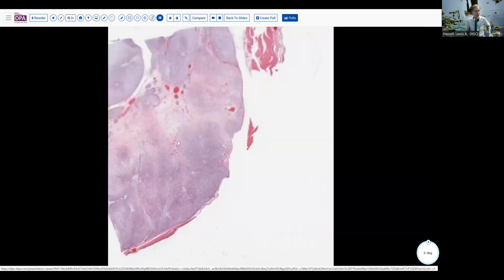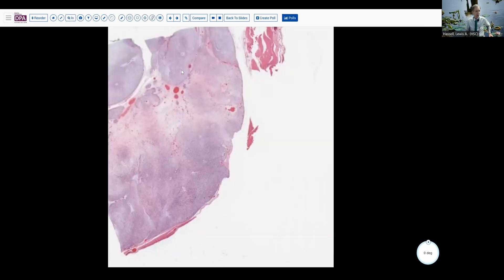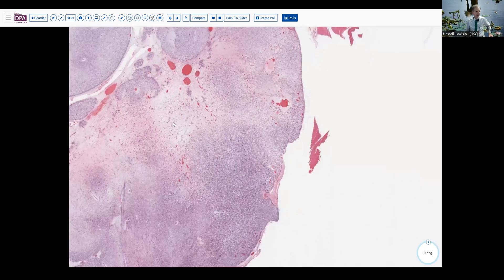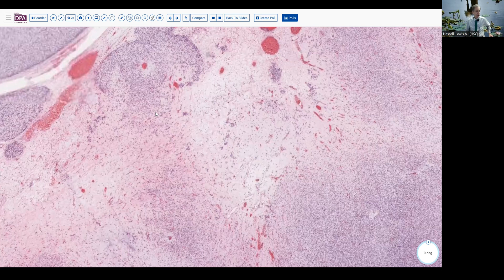And from that, we have some digital slides that we can look at. Here we can see it has a somewhat nodular appearance with variable cellularity, areas of low cellularity, very myxoid appearing, a few larger vessels, but not much in that regard. And then these sort of nested groups, as you see here.